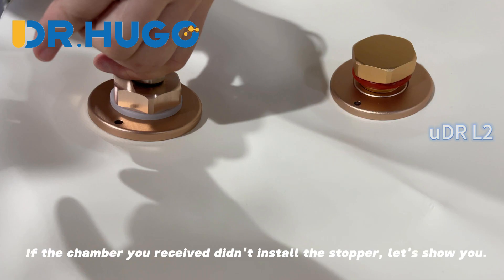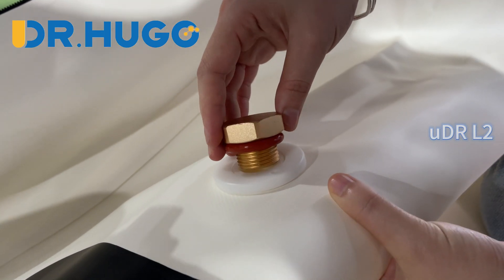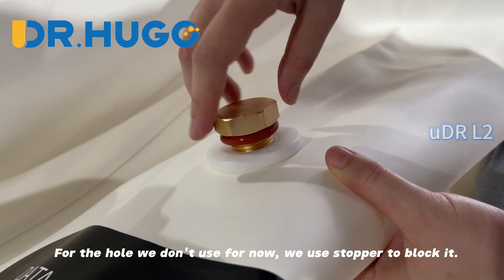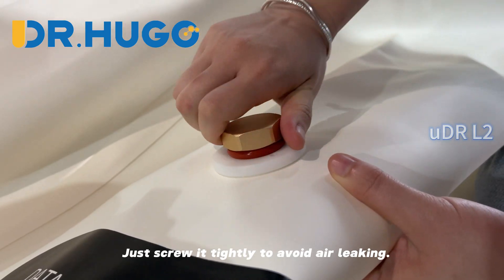If the chamber you received didn't have the stopper installed, let's show you. This is the hole for the stopper. For any hole we don't use right now, we use stoppers to block it. Just screw it tightly to avoid air leaking.